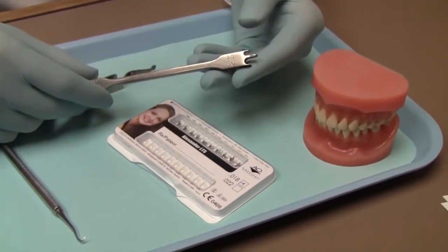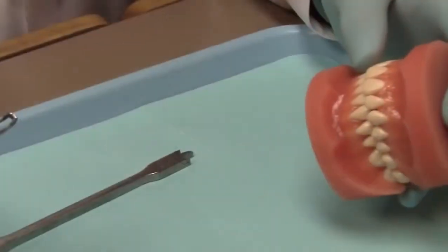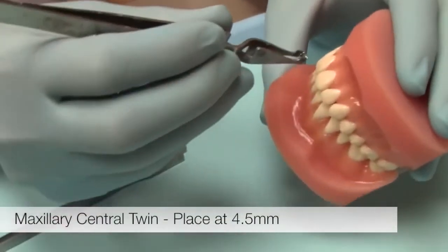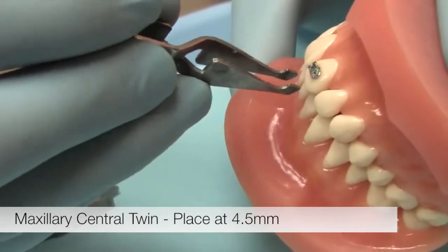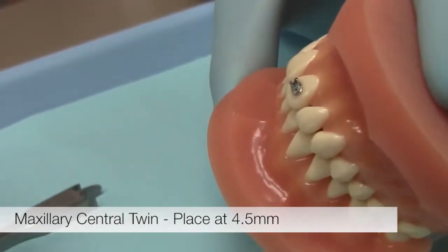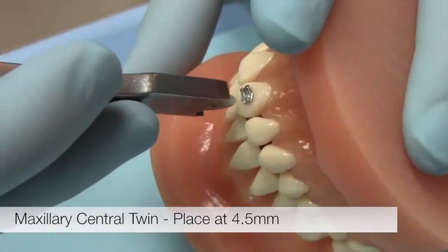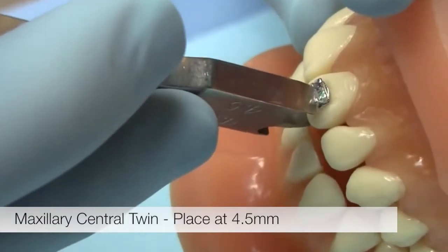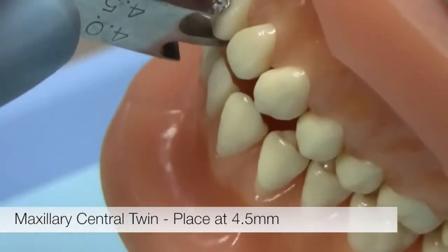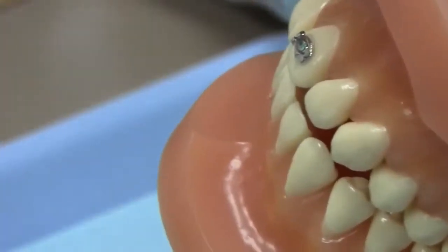We have a typodont here, our brackets, and our placement guide tool. The first bracket we're going to place is the maxillary central twin bracket. Pick it up, apply your adhesive, and place it in the center of the tooth. Remove excessive adhesive. Once it's in its position, take the placement guide to check for proper height, which for this bracket is 4.5 millimeters. For all other brackets, use the placement guide tool to check for proper height.